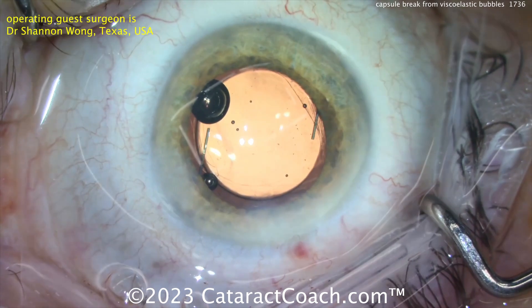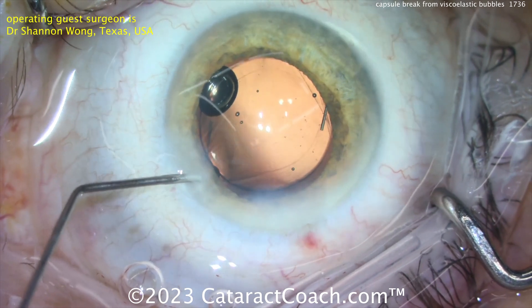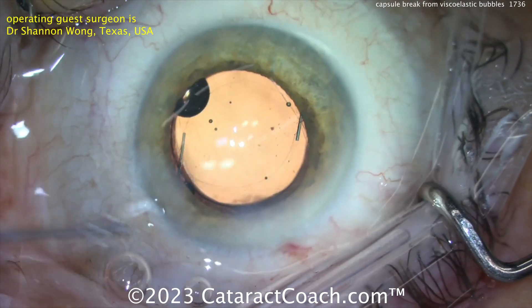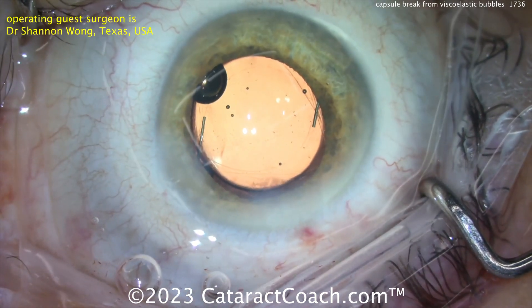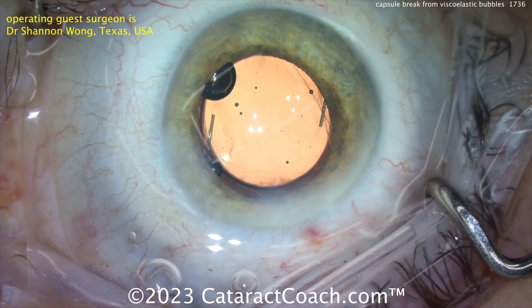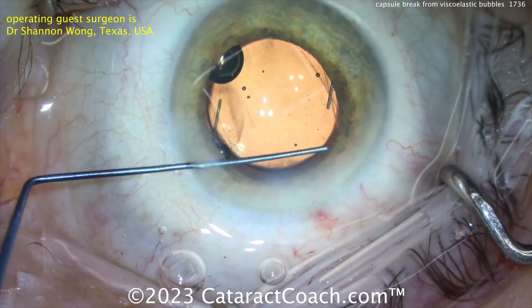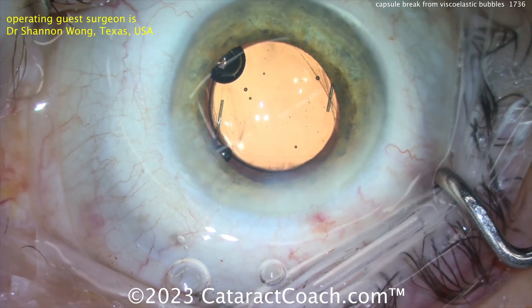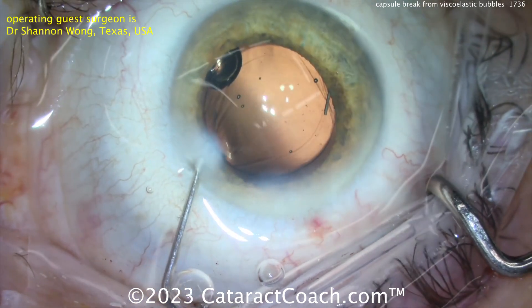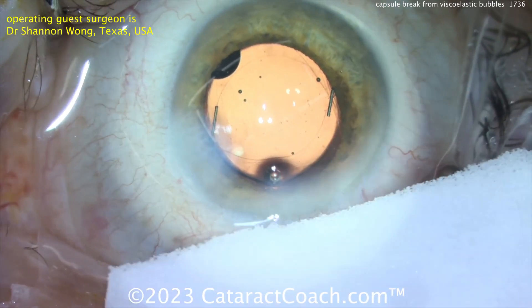Capsular complications can happen at any time throughout the entire surgery. When people question the value of cataract surgery, remember: this is a very difficult surgery with a razor-thin margin — we must be extremely cautious to ensure a good outcome. At the end, maybe put some triamcinolone in, but this looks like a great case — everything ends well. Thank you Dr. Wong for sending the video; I learned something new I had never seen before.